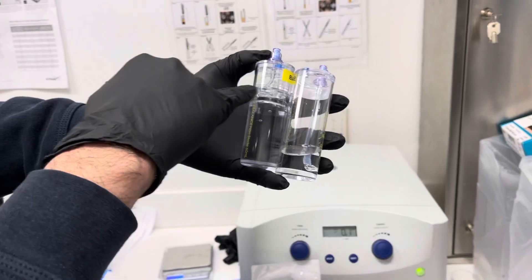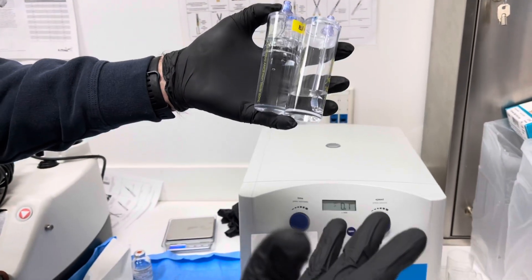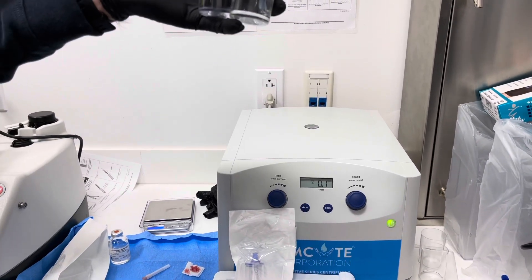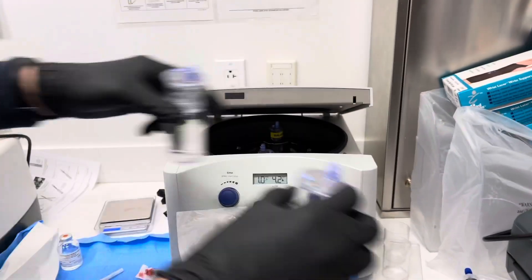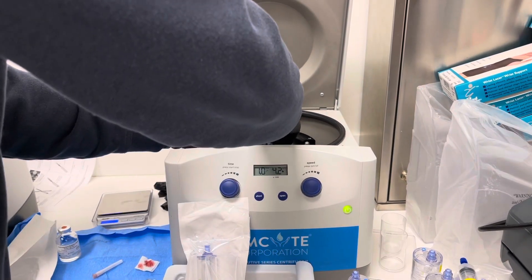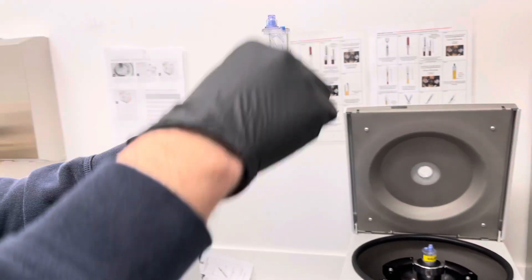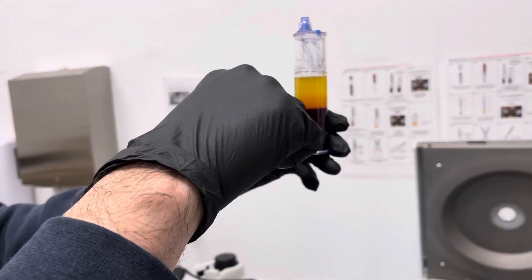The first one has the piston mechanism in it and the second one has the tube in it — all will become clear in a second. Basically the piston allows us to draw from the top of the sample down. If you think about it, this has just spun for a minute at around 180 miles an hour, so we've separated the sample into the hematocrit, granulocytes, agranulocytes — all the nasty stuff — and the platelets remain in suspension in the plasma up here.